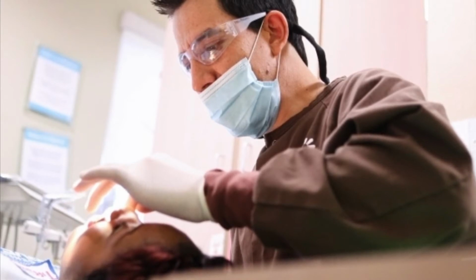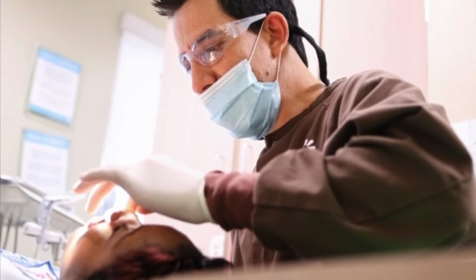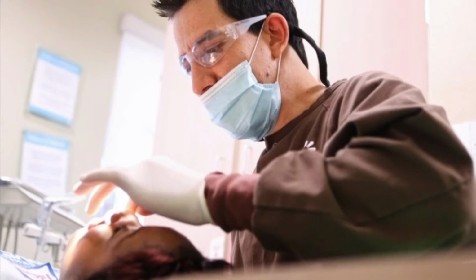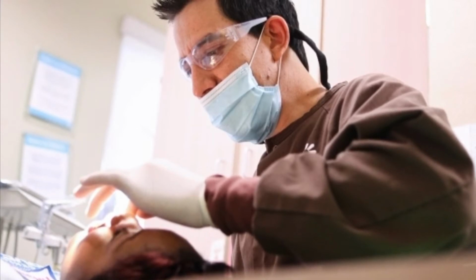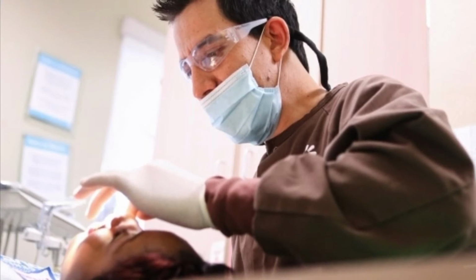Number 1, aid in localizing hard tissue. Number 2, location and shape. Number 3, estimate and confirm the length of root canals prior to instrumentation.